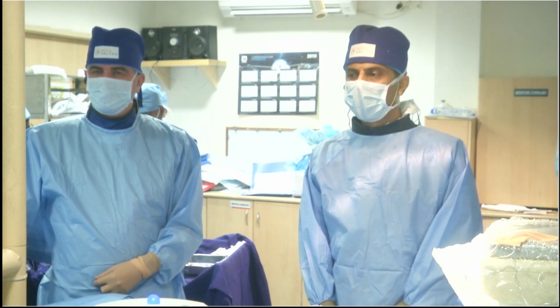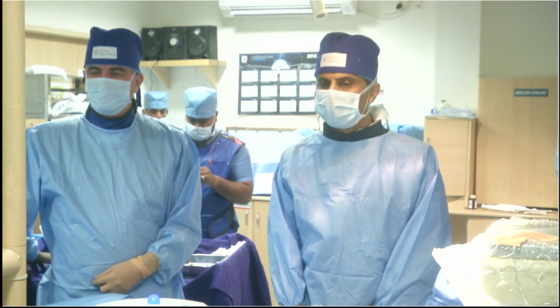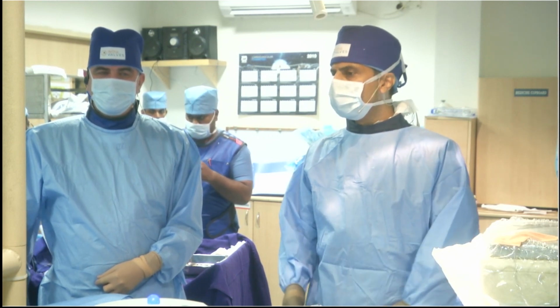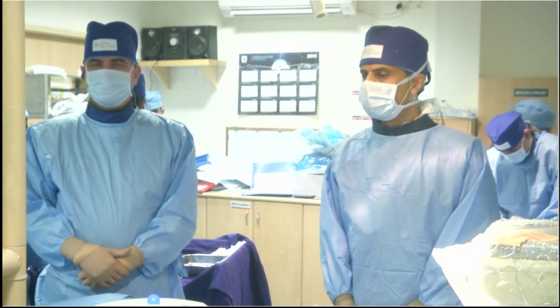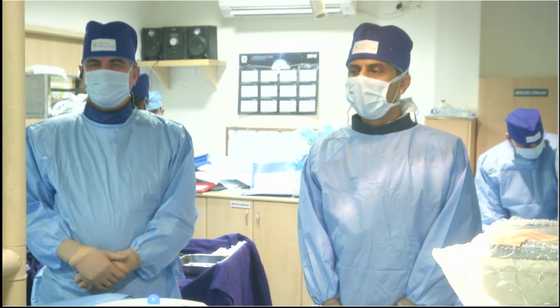Sure. I don't know if you are ready to start already? No, we are ready, but once you are done after the presentation, we can start. Okay, perfect. We are ready to go anytime. Kantaro will present the case, and we'll have some discussion before you start.